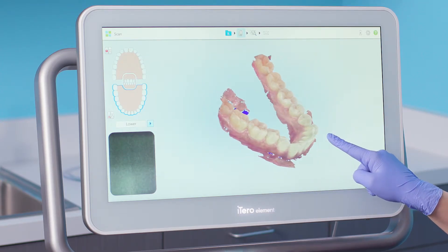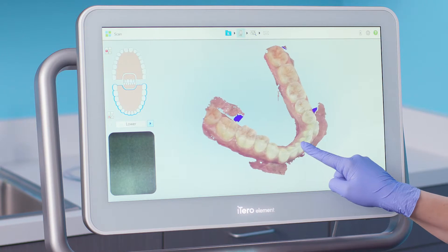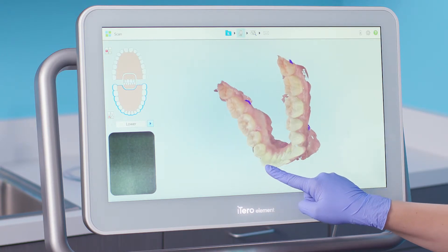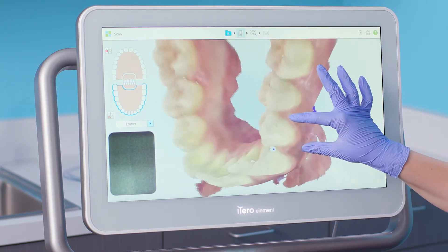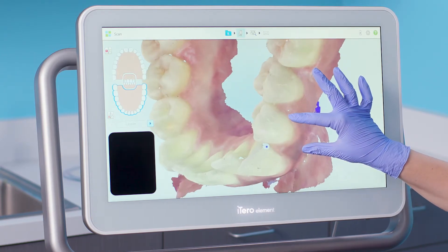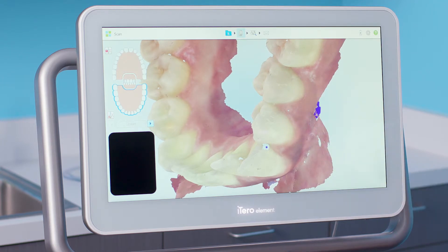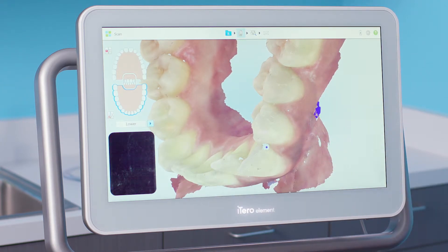This feature essentially creates a copy of the existing case as the new case type. The system will alert me to areas of missing anatomy with red in monochrome mode and purple in color mode.